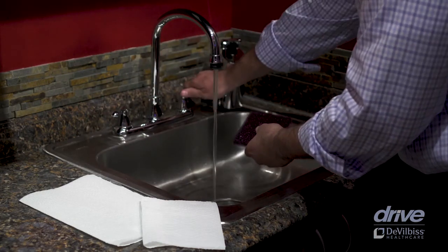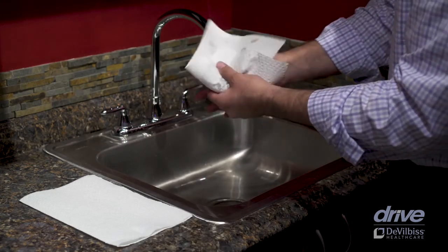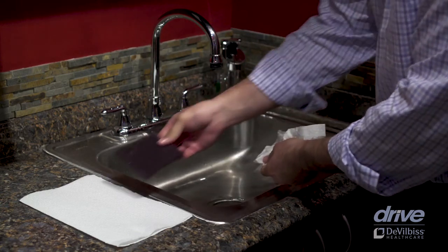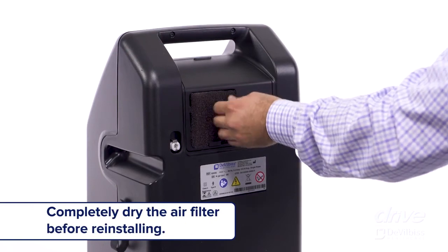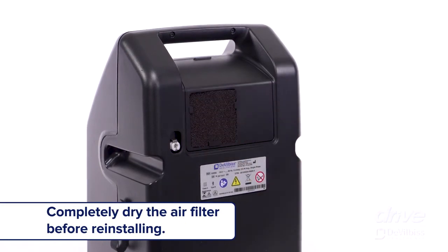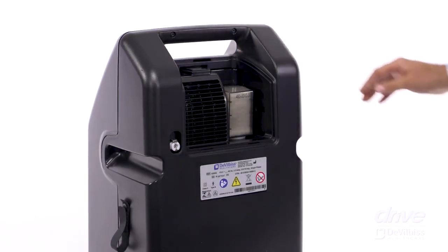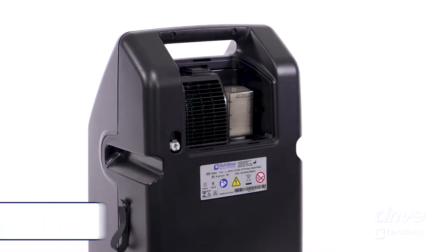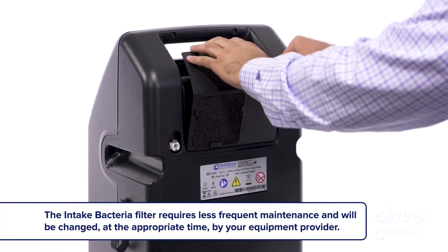Wash in a solution of warm water and dishwashing detergent. Rinse thoroughly with warm tap water and towel dry. Be sure the air filter is completely dry before reinstalling. Your intake bacteria filter should not be washed. This filter requires less frequent maintenance and will be changed at the appropriate time by your equipment provider.